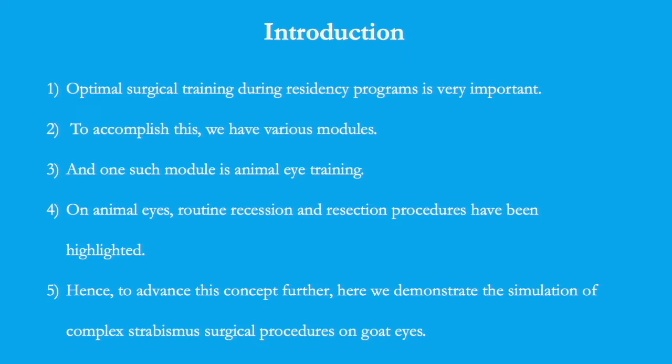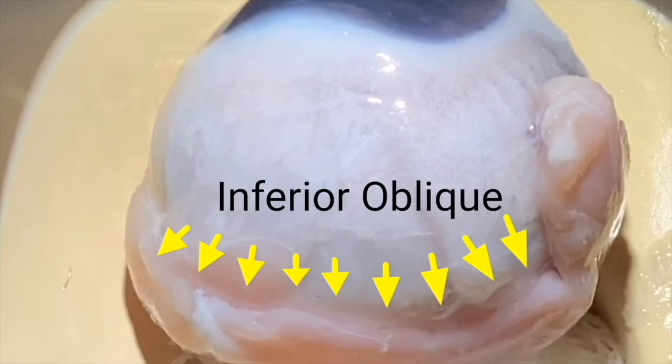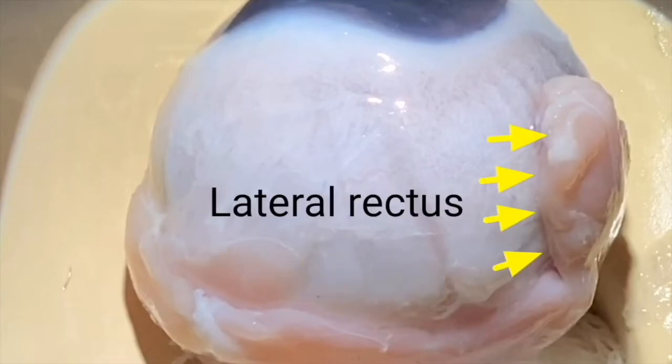Optimal surgical training is paramount during ophthalmic residency, and simulation procedures on animal eyes have been practiced since ages. The authors have previously described simulation of basic squint surgeries such as recession, resection, and plication on rectus muscles. Here we will be demonstrating complex strabismus surgeries simulated on goat's eye.